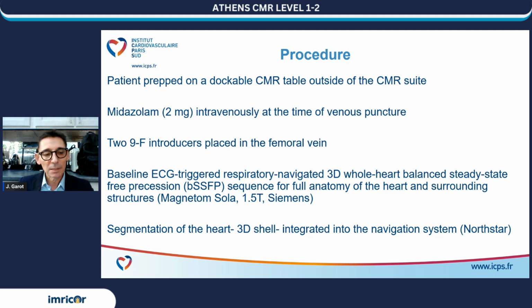Something important is that you have to acquire a baseline echo navigator, a 3D whole heart balanced SSFP sequence, for the acquisition of the full anatomy of the heart and the surrounding structures. We work on a Magnetom Sola 1.5 Tesla system.